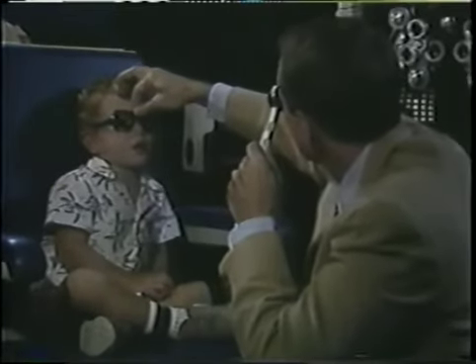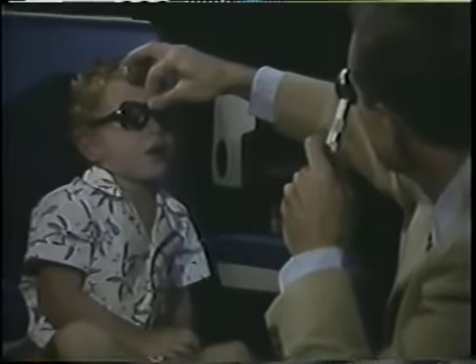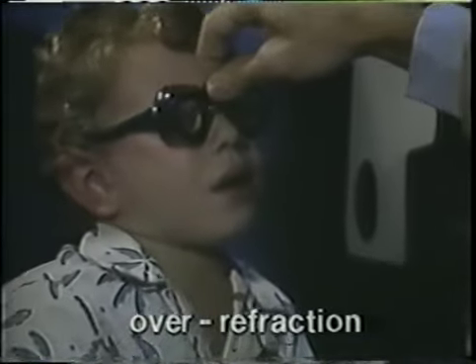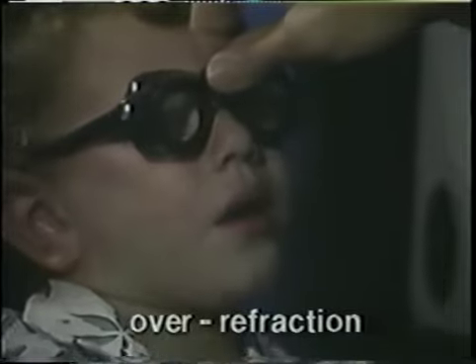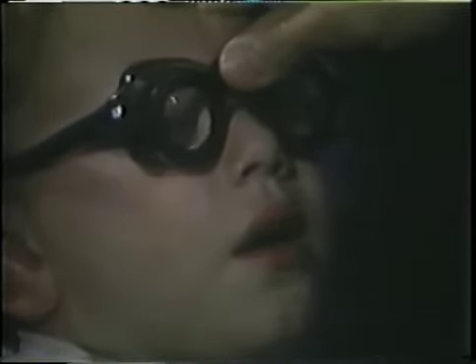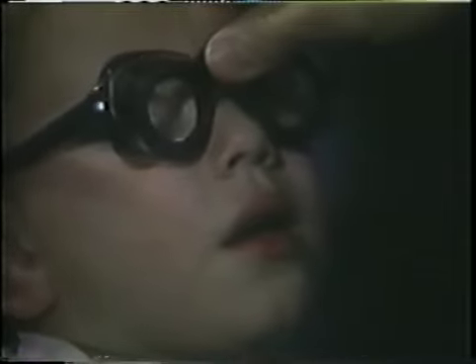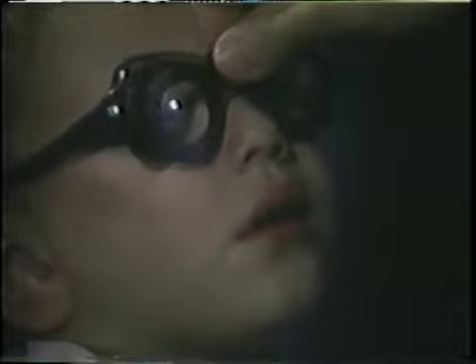One of the best time-saving applications of retinoscopy is in over-refraction. Holding up plus 1.50 spheres before a child's glasses, with a child looking at a distant target without drops, is the quickest way of confirming that the glasses are correct or are close enough to correct that they don't need changing.